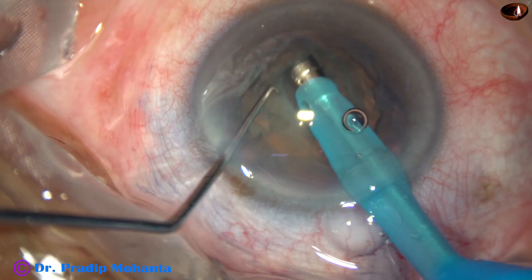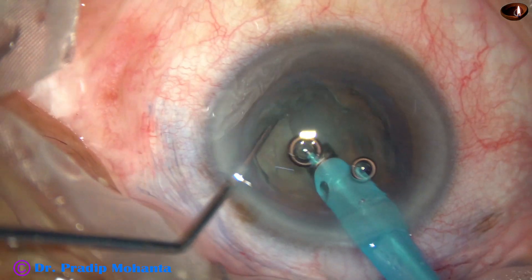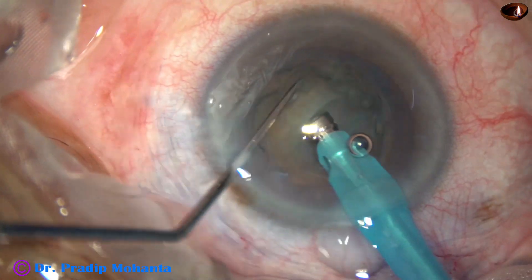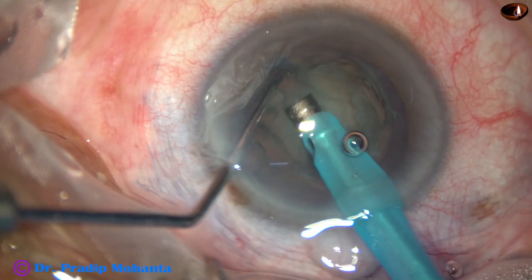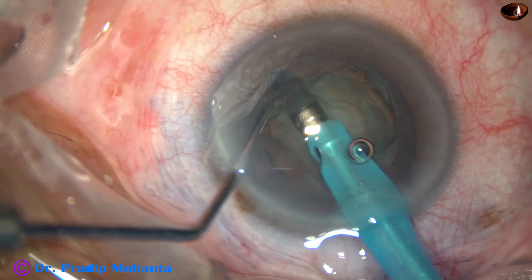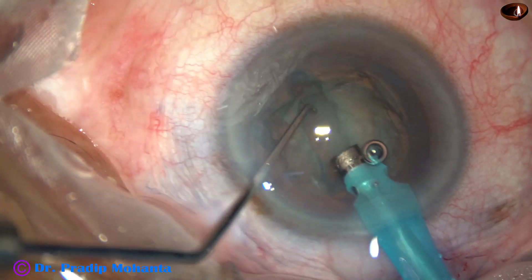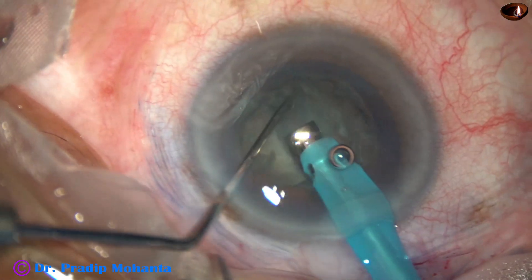In soft cataracts, we need not widen the trench. It can be just one tip width. It should be deep at the central part; the peripheral part need not be very deep.